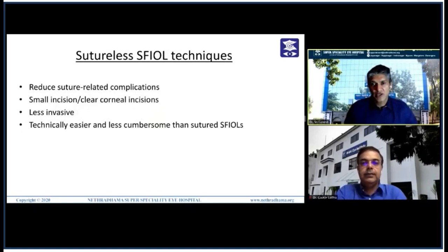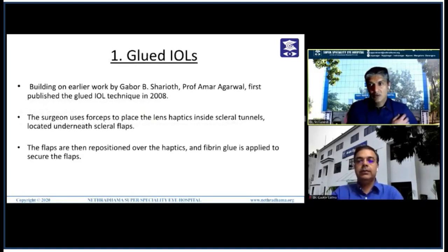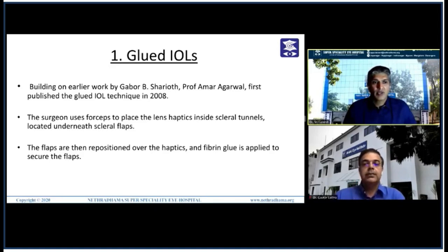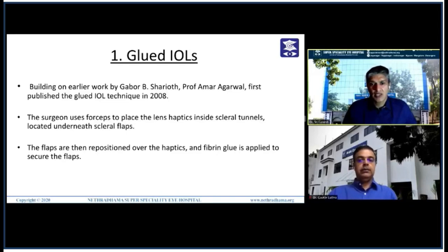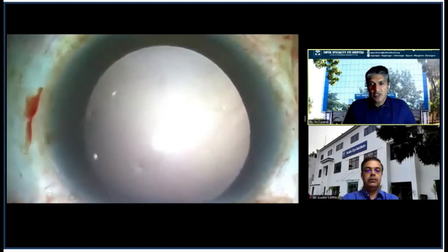Coming to sutureless scleral fixation techniques — these are newer techniques that have reduced suture-related complications. They can be performed through smaller incisions or clear corneal incisions, are less invasive, and technically less cumbersome than sutured fixation, but require some skill. The first technique is the Glued IOL, introduced by Professor Amar Agarwal, building on earlier work by Gabor Scharioth. First published in 2008, here the surgeon uses forceps to place the lens haptic inside scleral tunnels located under scleral flaps; the flaps are then repositioned over the haptics and fibrin glue is applied to secure them.